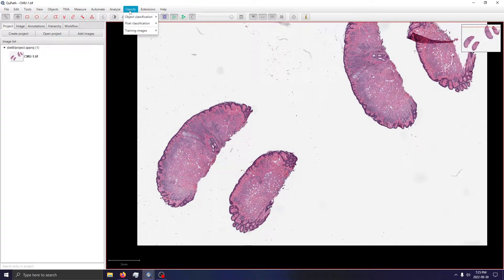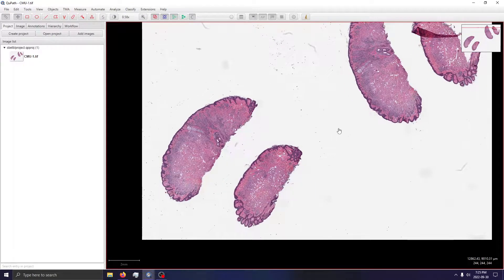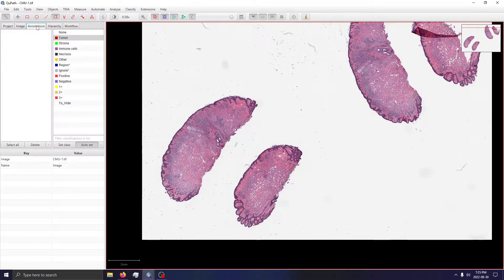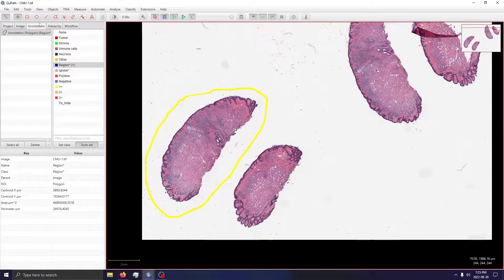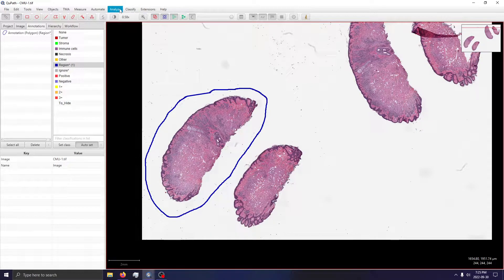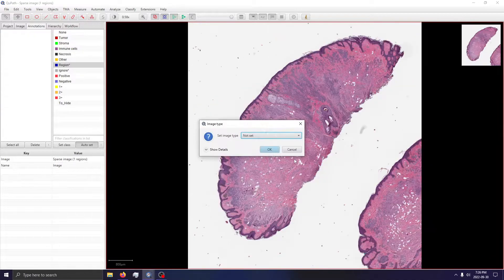One thing we can do is take advantage of the Create Training Images tool, which can basically turn an annotated area into a separate sparse image. Let's use this tool and give it an annotation class like 'Region.' We can see all those that are selected and just draw around the tissue section. I'll hit Ctrl+F to save this annotation, and then we can go and create a training image. If we select our class 'Region' and click okay, you can see it's now somewhat separated as a separate image.